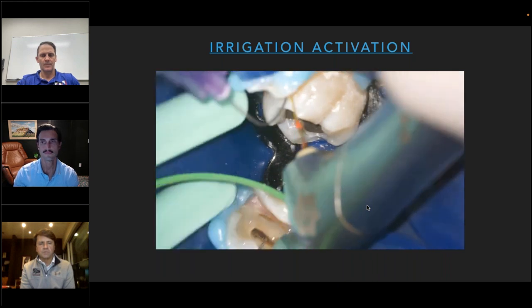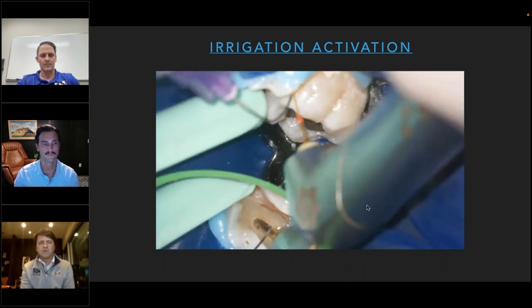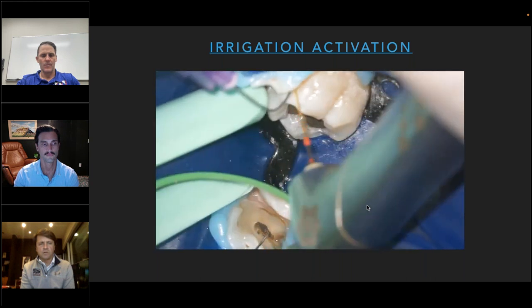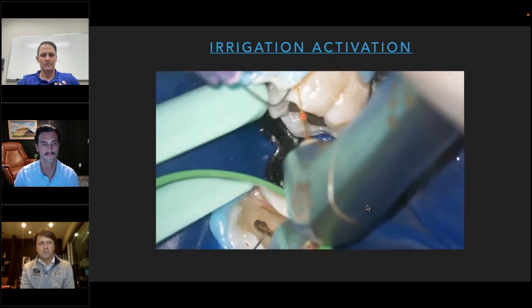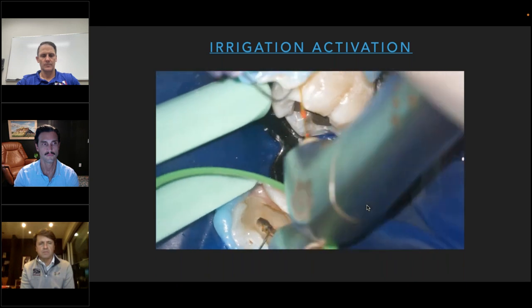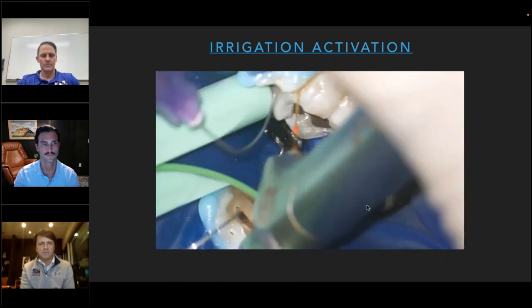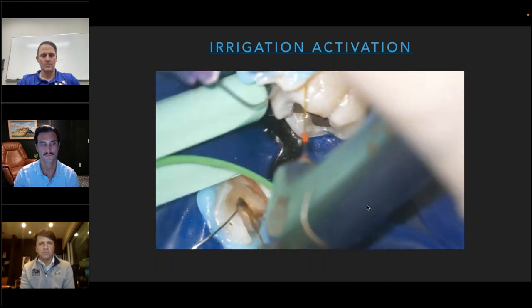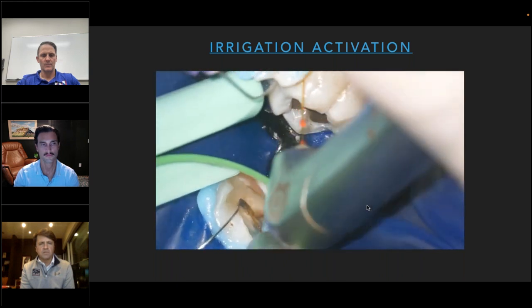Again, I think that's a little zoomed in version. This was a pretty difficult access for my assistant. I need to get better with what Charles was talking about with just filling the chamber and not necessarily replenishing the whole time, because my assistant was really struggling to keep her tip kind of where I needed it. A little more, you can see the discharge of heme and debris from the buccal.